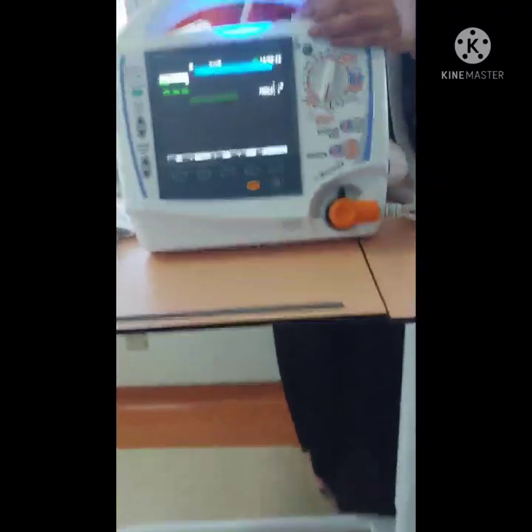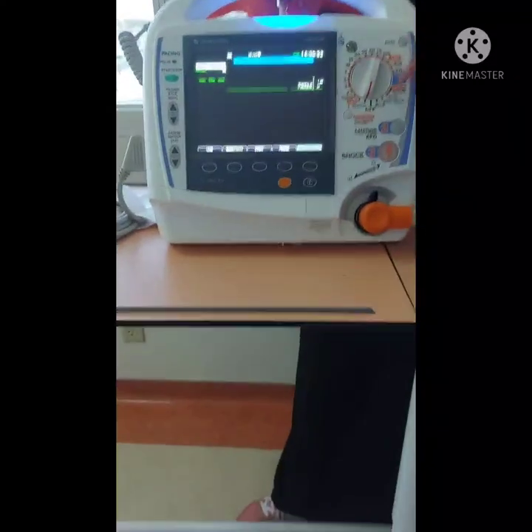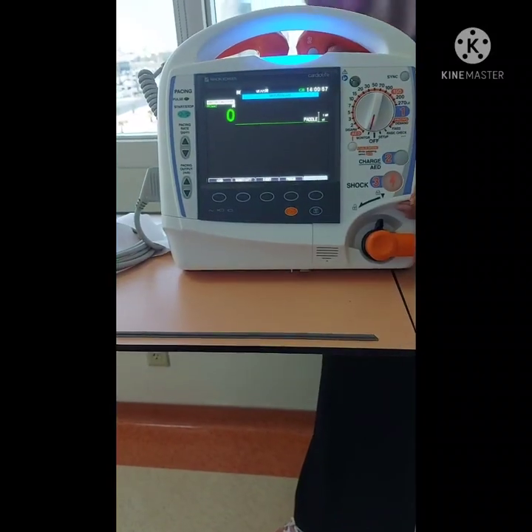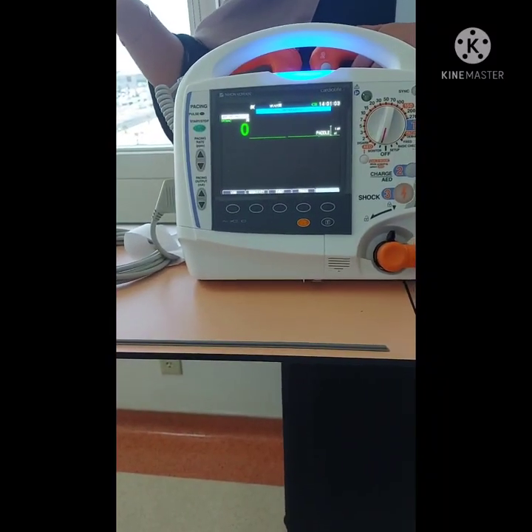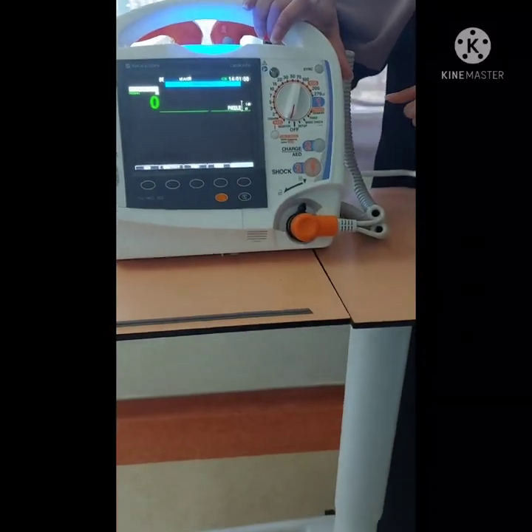We cannot do that to the machine? Unfortunately, no. You can lower the volume, I'm going to show you in a minute, but you cannot mute it at all. And she will go through the steps one by one until you deliver the shot to the patient. Fully guided. Okay, but what if you want to give it to a child?